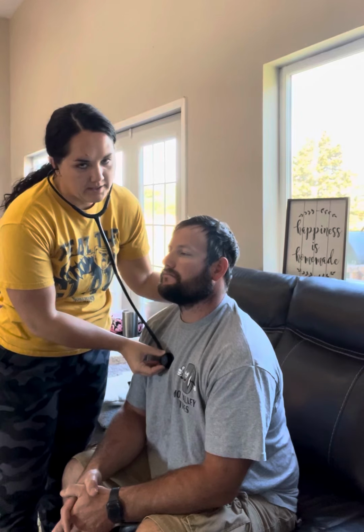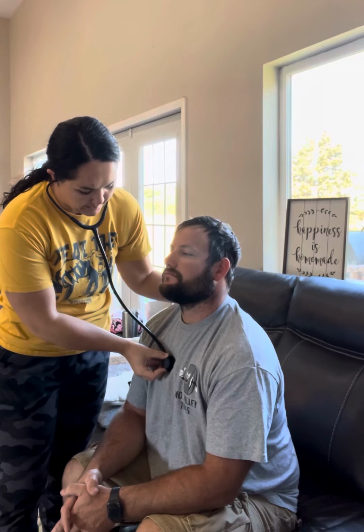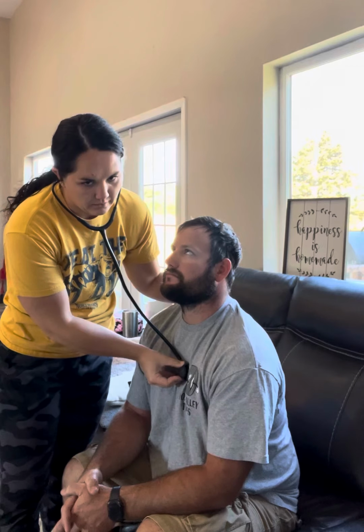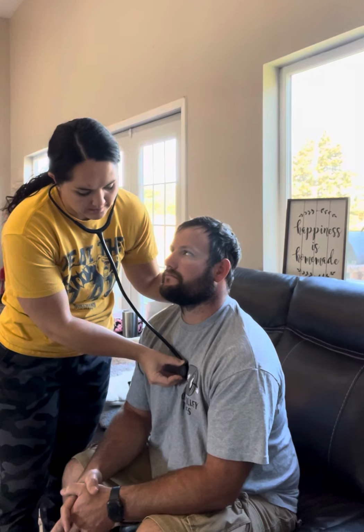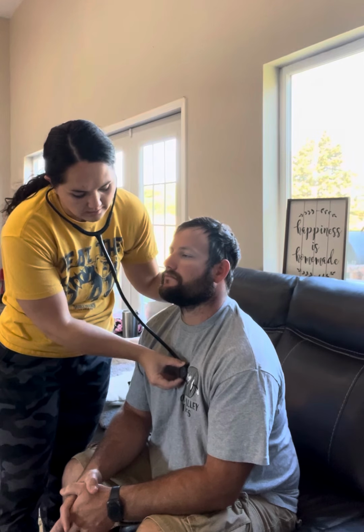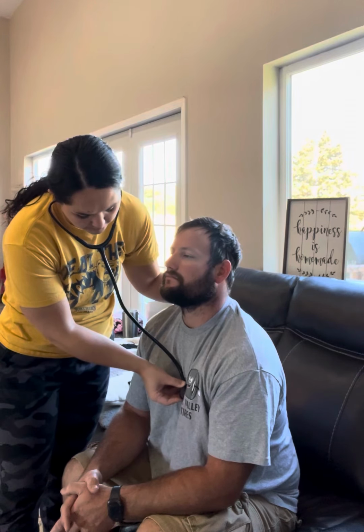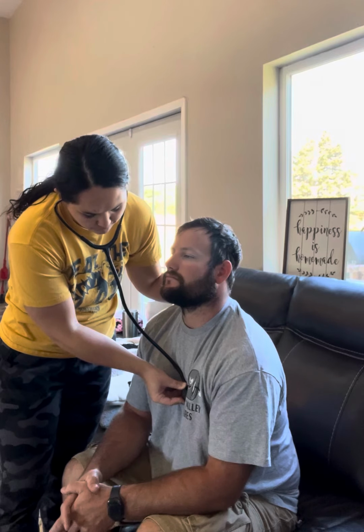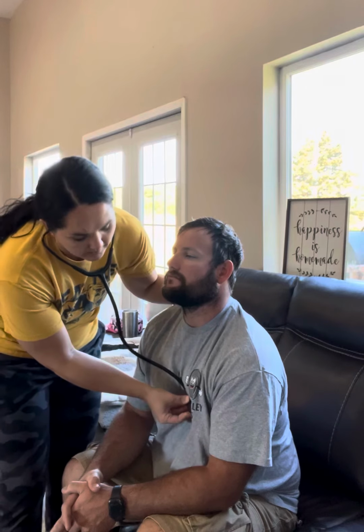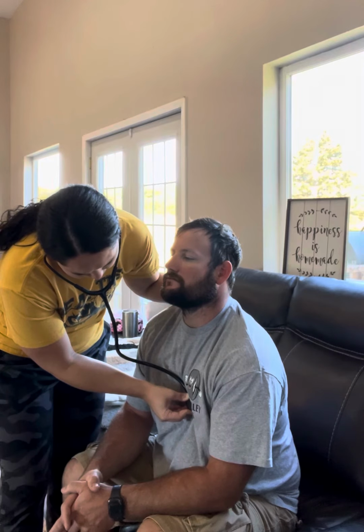So we're going to listen to the aortic, which is the second intercostal space on the right. And we'll go over to the pulmonic, which is the second intercostal space on the left. And then the tricuspid, which is through the third and the fifth intercostal space. And then the apex.